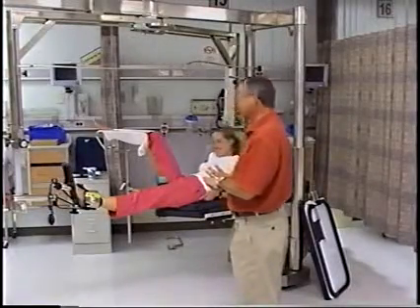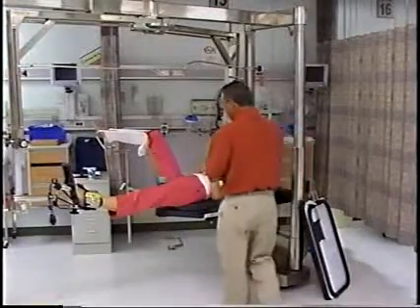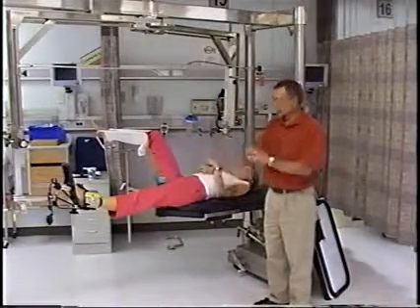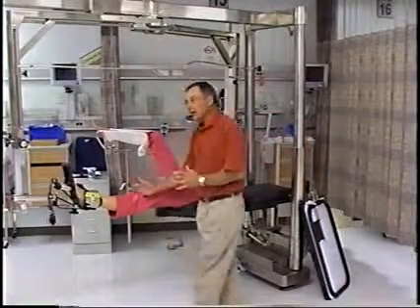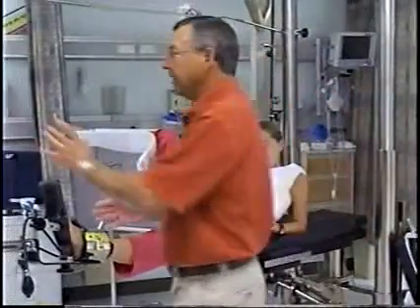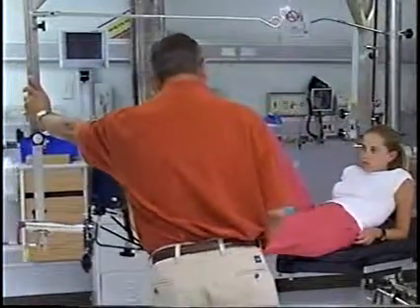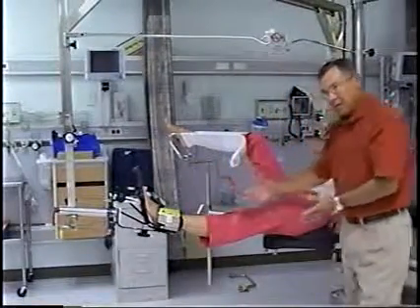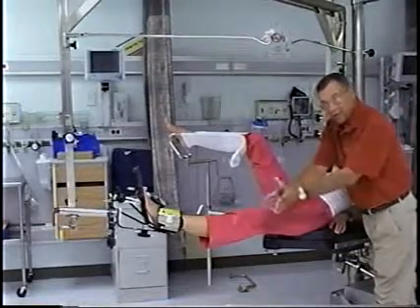Not yet. Now, let's assume that the doc is also doing a femur, or going to do a femur later on. If you can set this up for a left hip, you can set it up for a left femur, because the only thing they're going to do different with a femur is they're going to adduct. Remember, adduct means to add to midline. They're going to adduct across midline so that they're coming in this way instead of straight on.